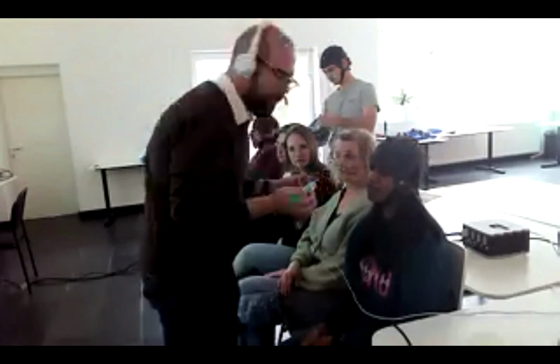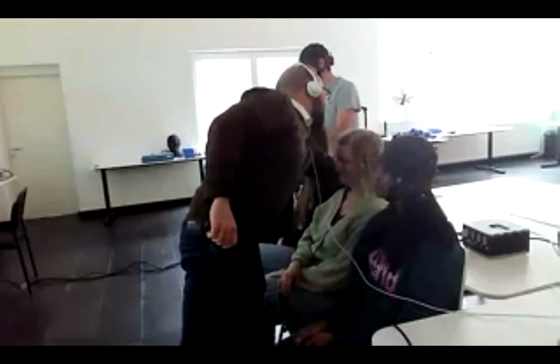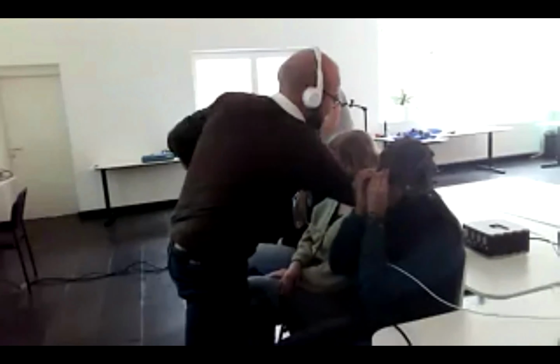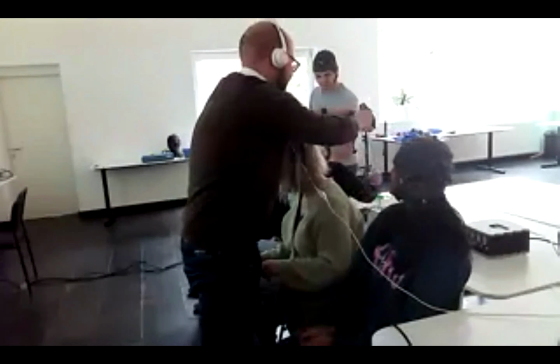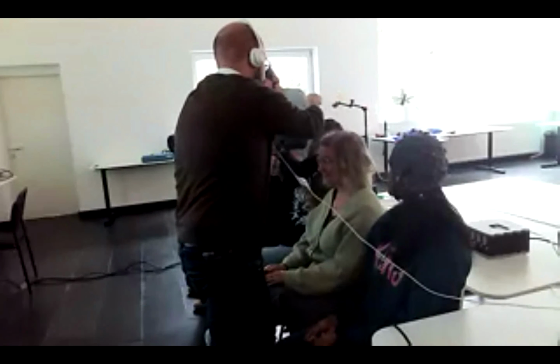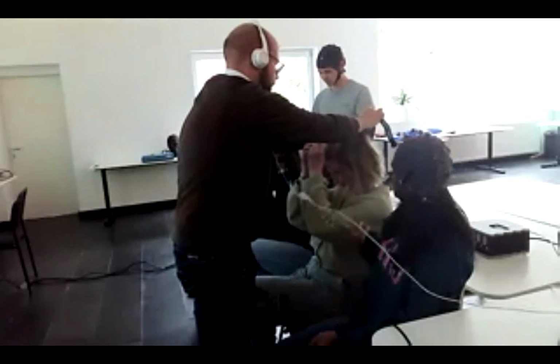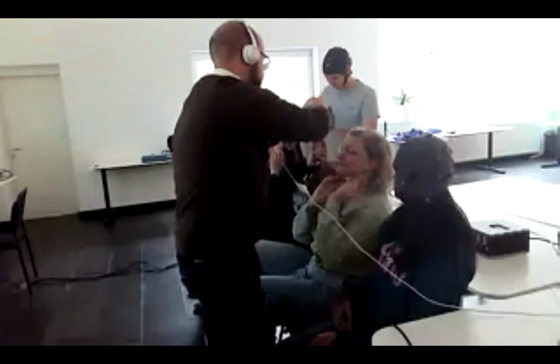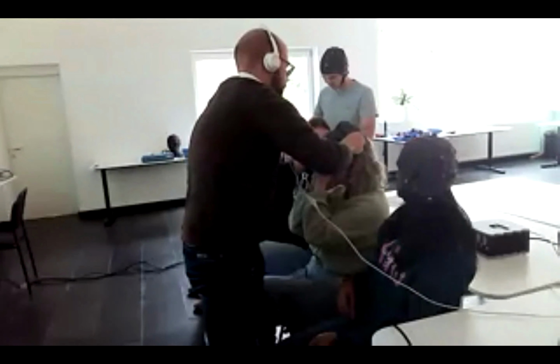Oh, good. The manga, how are you doing? So far, so good. Can you just lift up? Yeah, exactly. Stop. Can you just put your hair a bit to the back? Yeah, exactly, behind the ears. And hold it from the front.